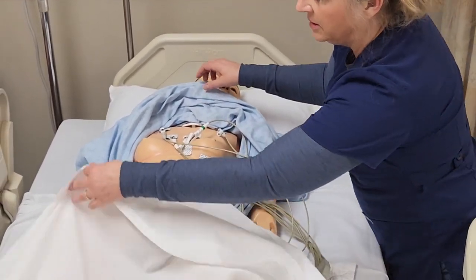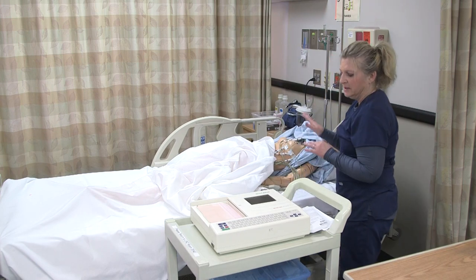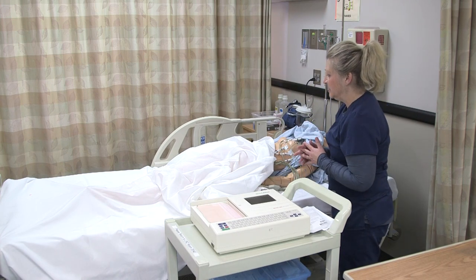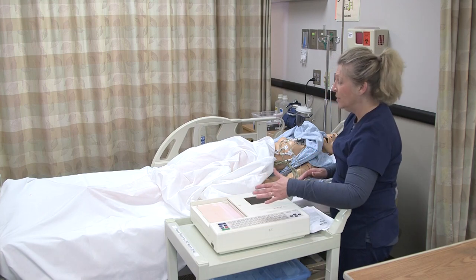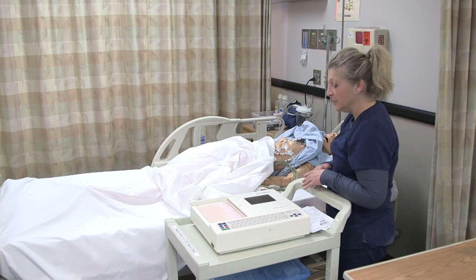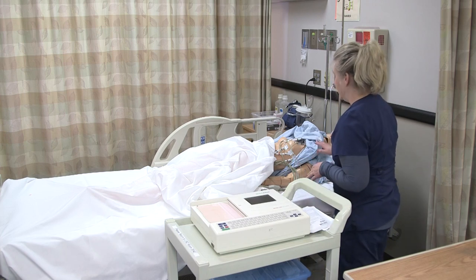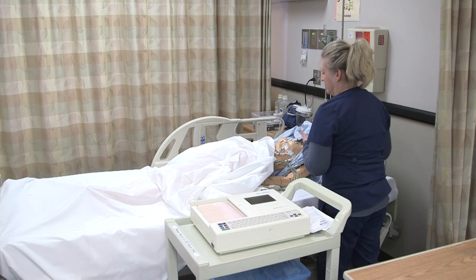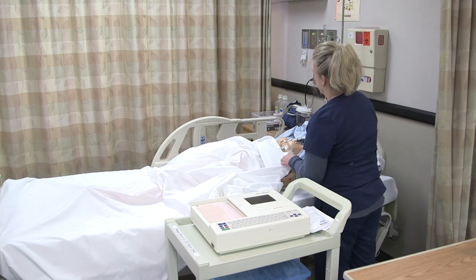Once we have all of our electrodes on, we tell the patient to lay still as much as possible, then we go ahead and generate our report. When we're done generating the report, we look at it — if it looks to be a good reading, we can tell the patient that we are done performing our EKG and complete that task.